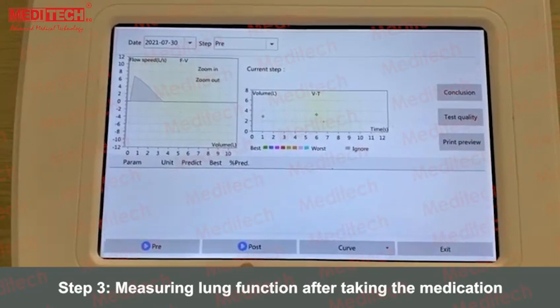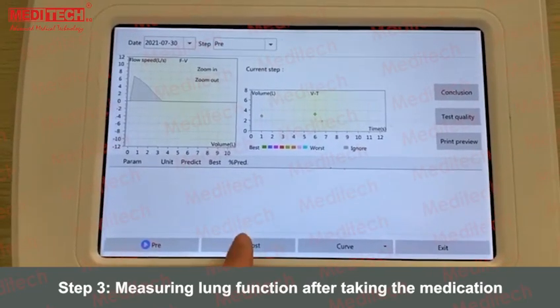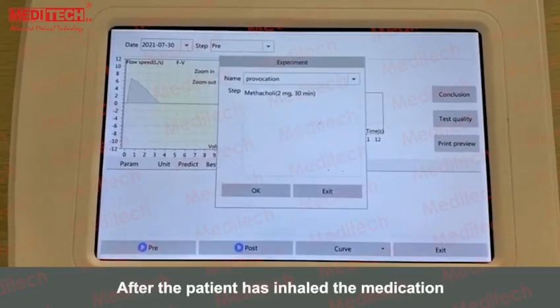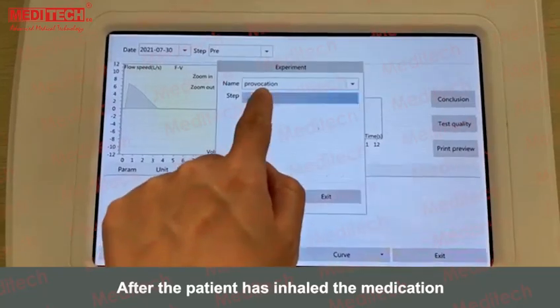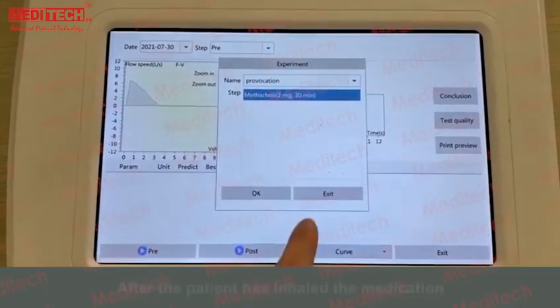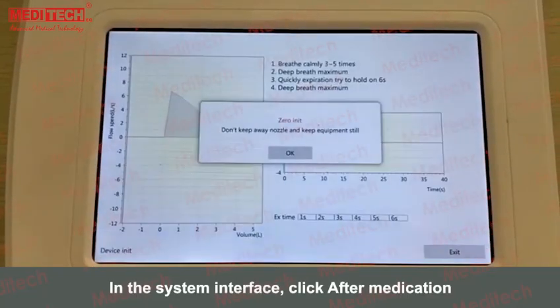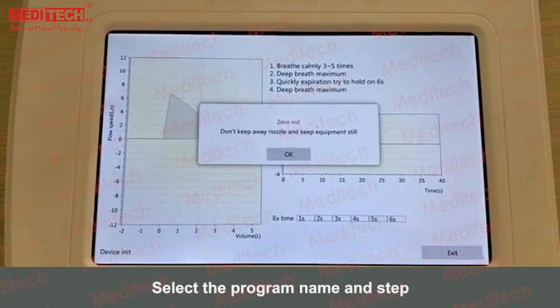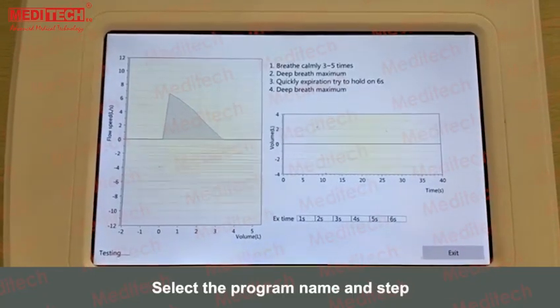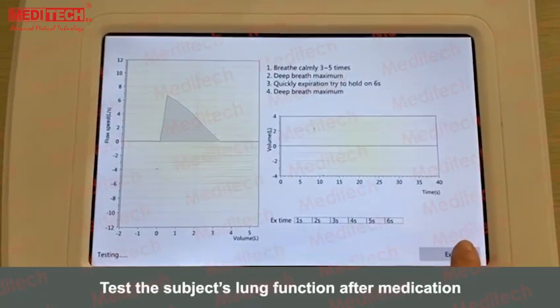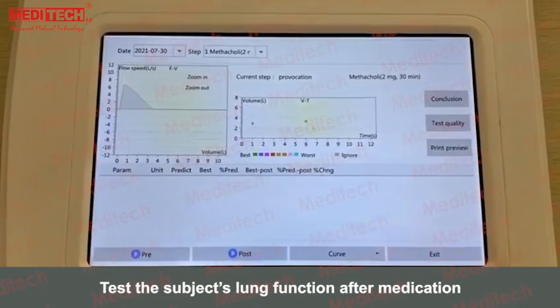Step 3: Measuring lung function after taking the medication. After the patient has inhaled the medication, click After Medication in the system interface. Select the program name and step, then test the subject's lung function after medication.